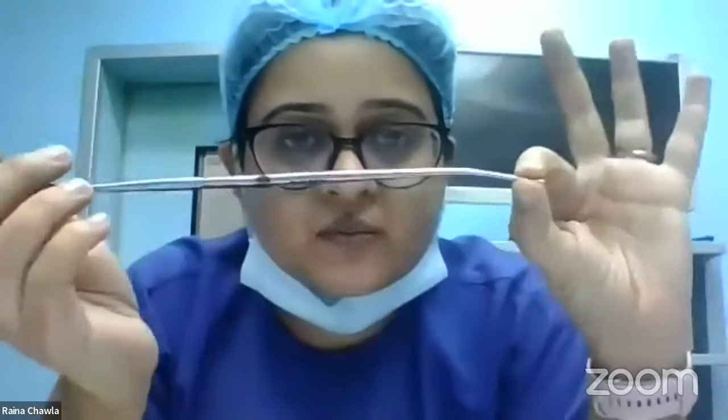And how do we know the procedure is complete? When we get a grating sensation. Like when you use a grater to grate something, you get the same grating feel on all the uterine walls. That means your procedure is complete. What are the other signs of completion of procedure?